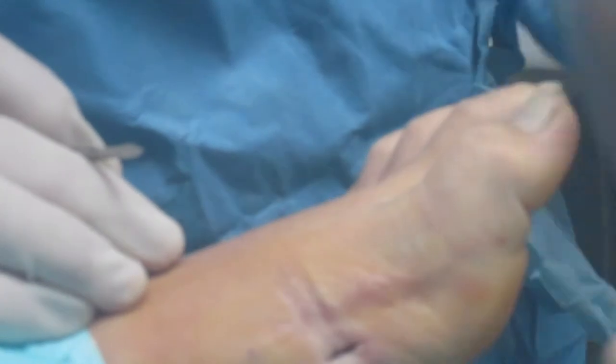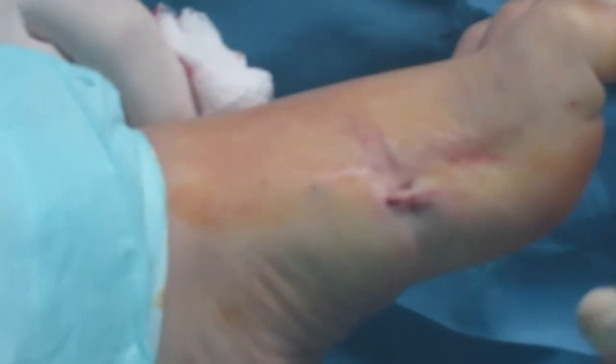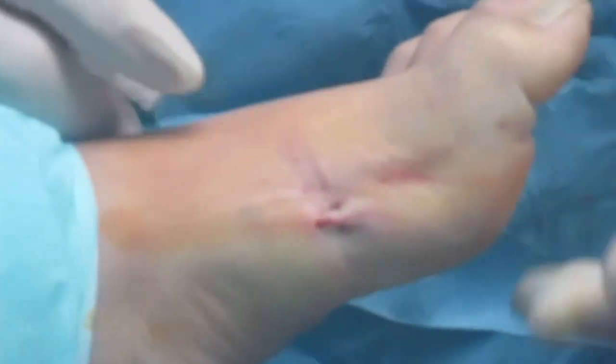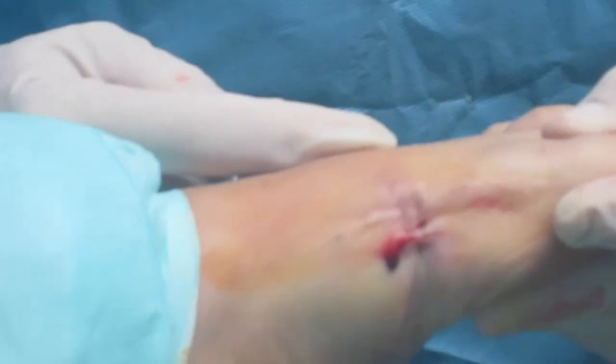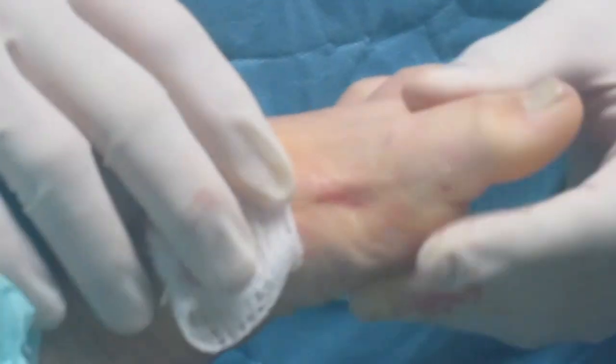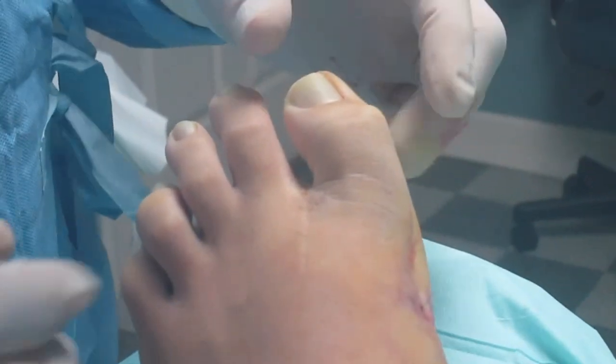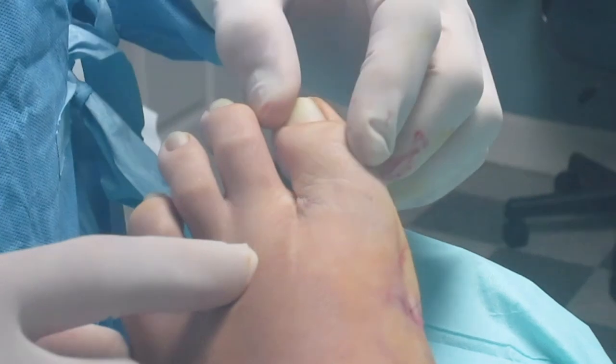So you're done with that part of the procedure, so you're halfway done. Okay, this part of the procedure is already complete. We just put one suture in there, and that should hold that, just a skin suture. If you look at her foot now, you can see it's already a lot better. Her toes are not all over like they were immediately. So this is a good way to start the procedure and see what kind of correction you need at the joint up here. This part is our minimally invasive part, which we're going to do with our minimally invasive techniques.